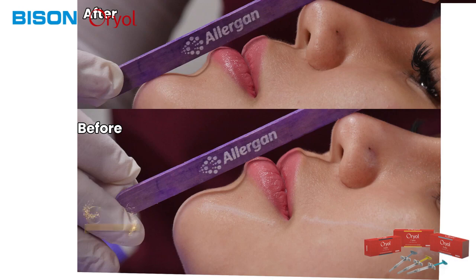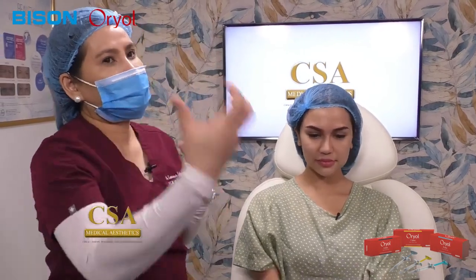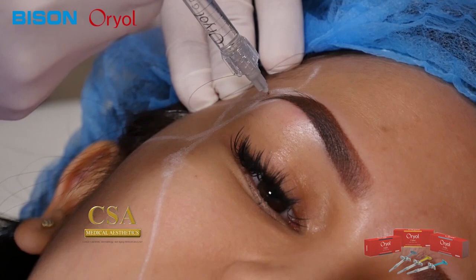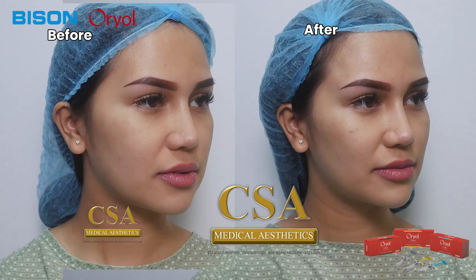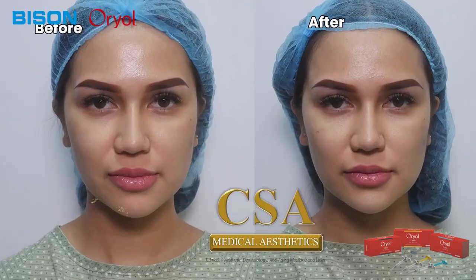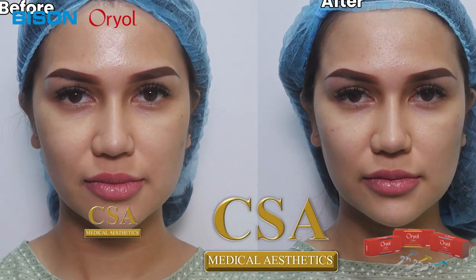So with that technique, just following those lines, you can do an improvement, a lifting, restoring volume, doing projection with the help of our 2 syringes of hyaluronic dermal filler, and a simple technique of needle method with bolus injection on top of the bone. So for women, we love contouring, right? Like we highlight on the cheek area, the cheekbone, and also some will do highlighting on the chin, and highlighting the upper third of the face. So it's like contour makeup too, okay? I also noticed the tail of the brow and the upper eyelid was lifted. So your eyes were opened.